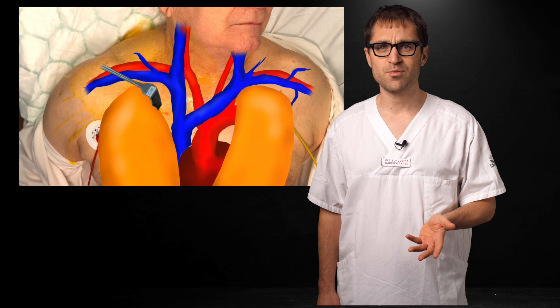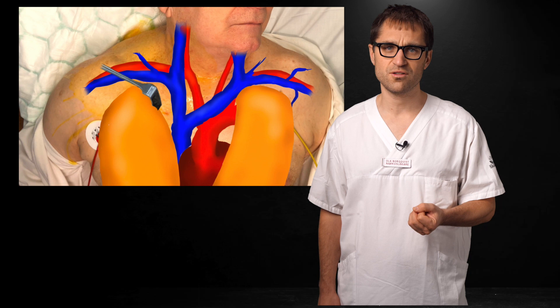Identifying the subclavian vein can be a bit more challenging. The vein is most often located ventral and caudal to the artery — in other words, it's shallower and further down. The vein is found below the clavicle, as you know from the traditional landmark technique.